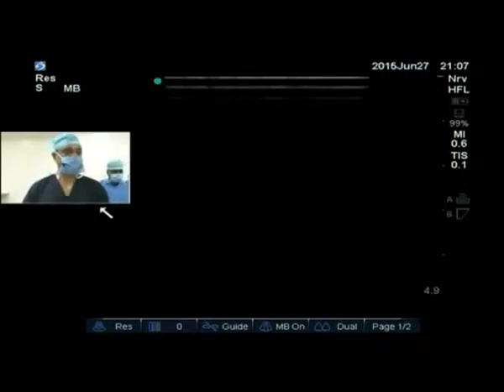As my colleague just announced, his fasting blood sugar is 401, and this being a sort of an emergency, it is quite a smelly wound. So unless we achieve some sort of a source control, his sugars are definitely not going to be controlled. So what I will be doing for this patient is an adductor canal block to block the saphenous nerve, which will give him analgesia along the medial aspect of the leg beneath the knee joint.